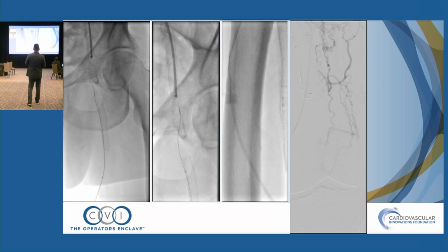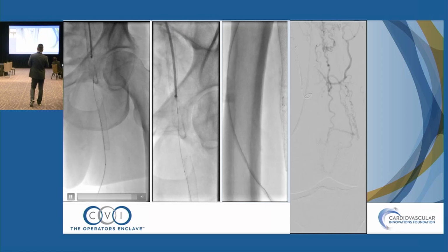Eventually got through here, exteriorized, put the wire into the sheath. One technique I do once I put it into the sheath is I pass the wire, and then the sheath valve is here. So I basically take my short access sheath and I push it into the valve, and then I just watch the wire go through that check flow valve, and I pull that, and then I have the wire. Okay, so I exteriorize the wire, and now I reverse everything, and I basically bring my equipment down past this access point, which is right here, and go as far as I can.